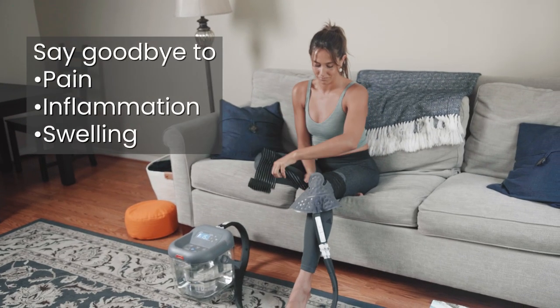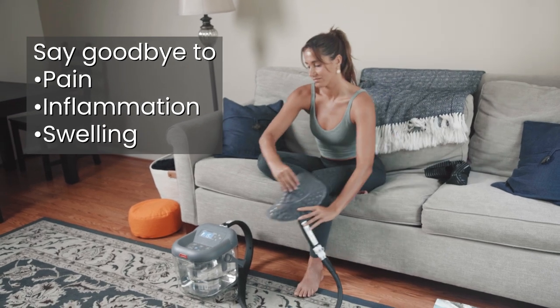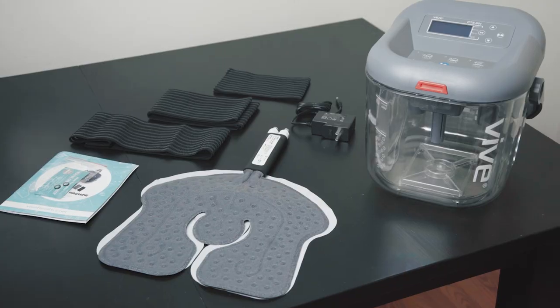Say goodbye to pain, inflammation, and swelling from injury or surgery. The Vive Ice Therapy Machine is your key to a quick and comfortable recovery. Let's live better.